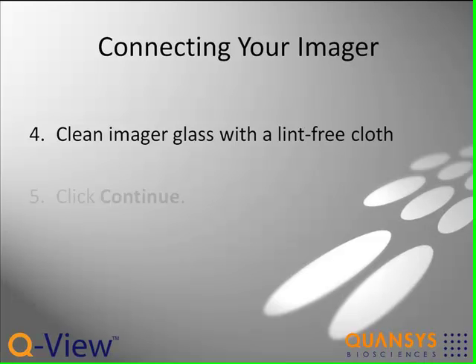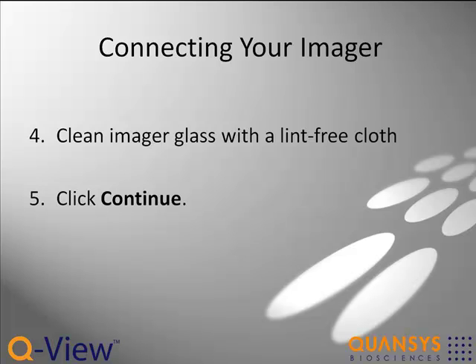After you've connected your imagers, click Continue and Q-View will begin scanning for your imager. Once Q-View has recognized the imager, click Continue and follow the instructions on calibrating your imager.